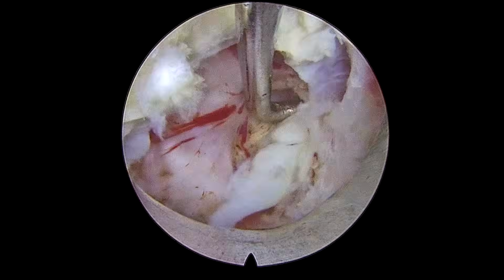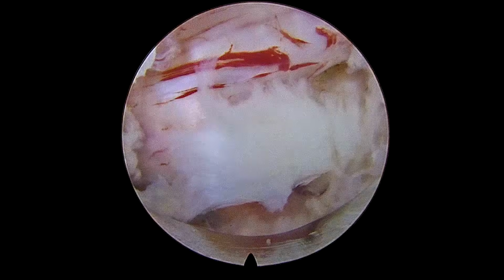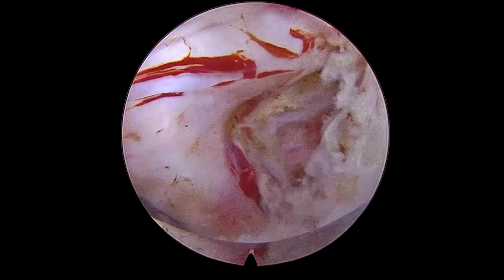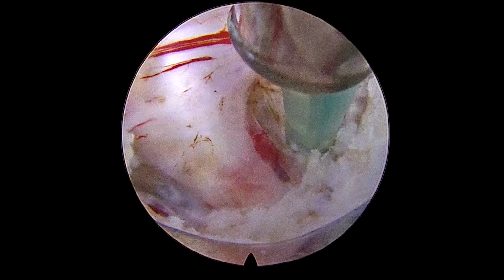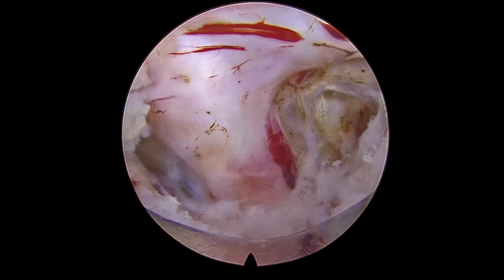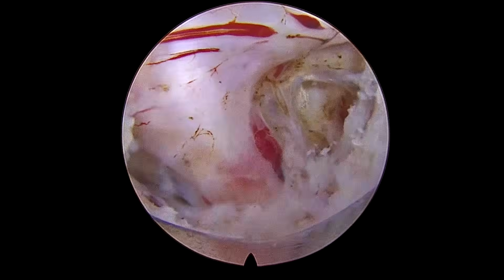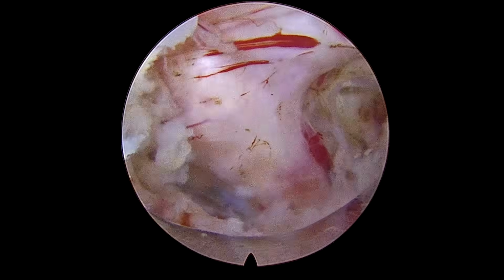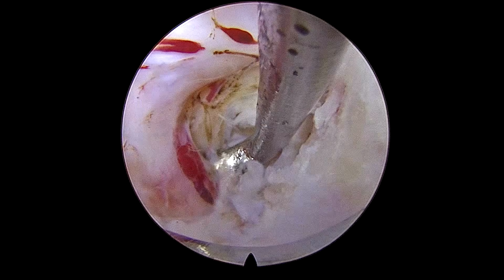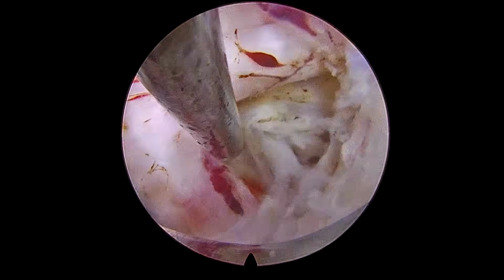It's a huge one. A few more fragments are coming out.